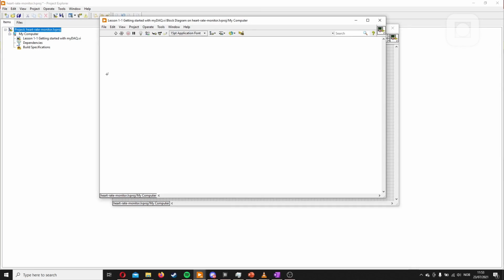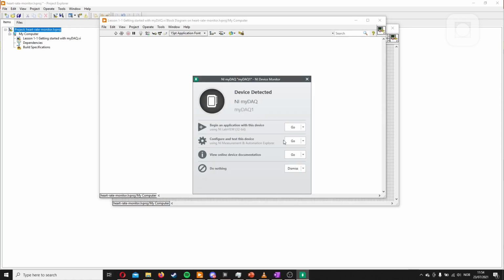If you haven't already, you need to plug in the MyDAQ. When you plug in the MyDAQ, this should appear. If this doesn't appear, I would go to an earlier lesson where I talk about what to install, drivers, etc., as you might not have the correct drivers installed. For now, we'll just continue. We'll just click it away as we already started the project we wanted to.